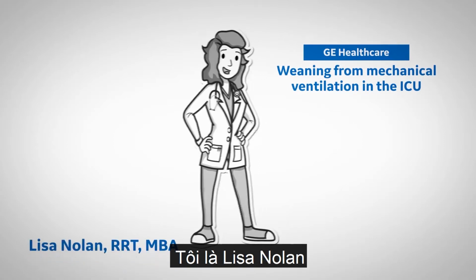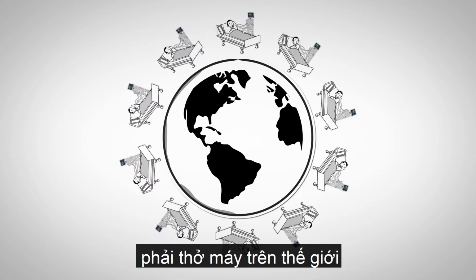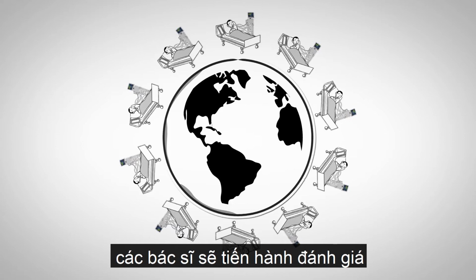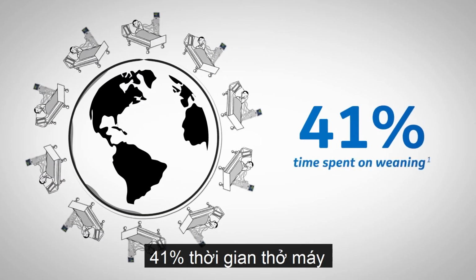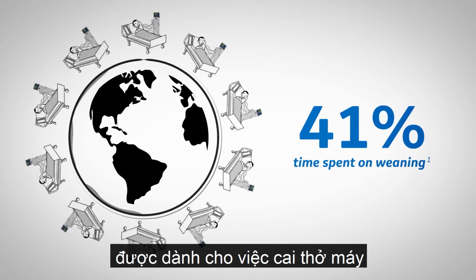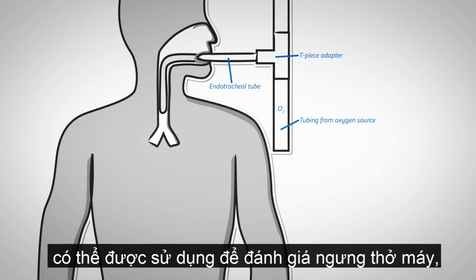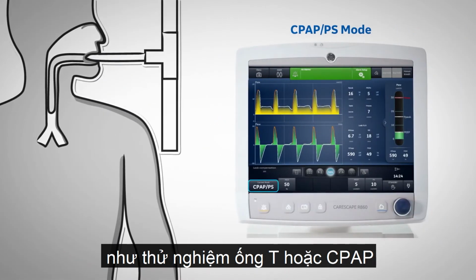I'm Lisa Nolan. Each year, thousands of patients are mechanically ventilated worldwide. As a patient's condition improves, clinicians will evaluate the need to discontinue the ventilator. Did you know that 41% of mechanical ventilation time is spent on weaning? There are various methods that can be used to evaluate ventilator discontinuation, such as a T-piece or CPAP trial.